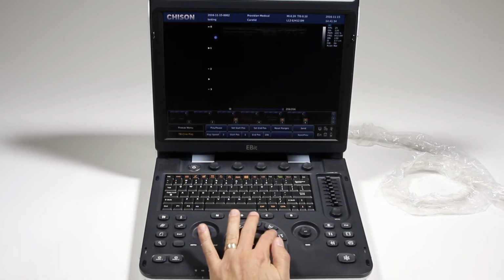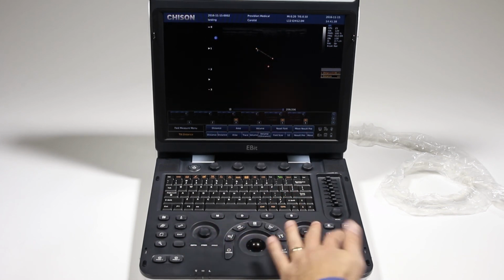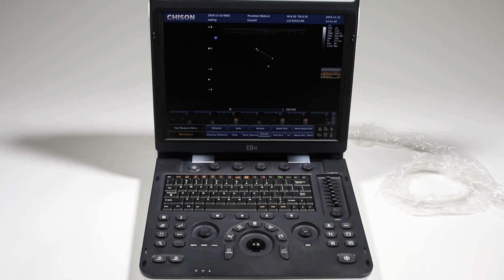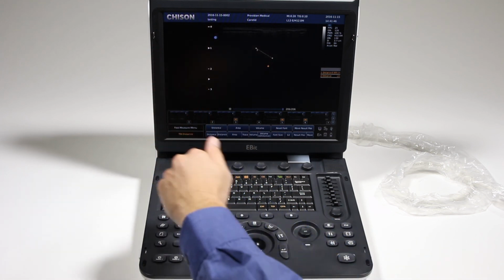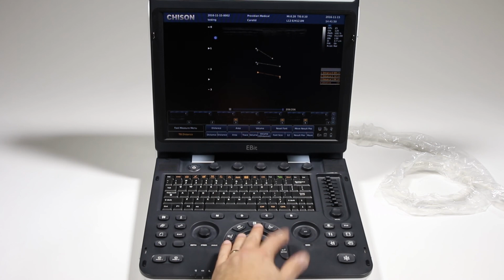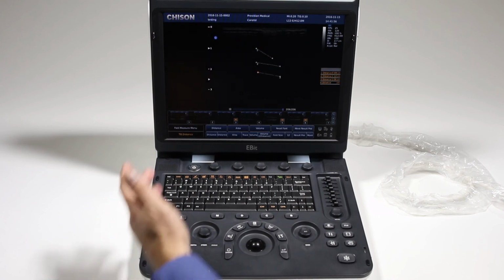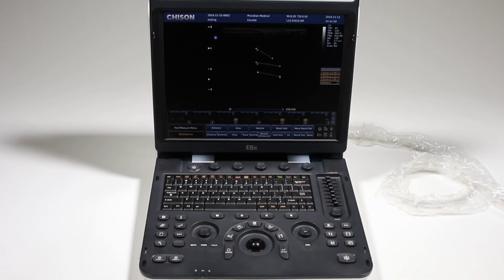These work the same, the distance and trace. If I just want to take a quick distance measurement, I can go ahead and do that and save the image. Note that any measurements here will not go onto report because they're not assigned to any report or calculation package. This is just for a simple measurement. If you take all of these, they will not show up in the report because it doesn't have anything to assign it to in the report. It really doesn't know what you're looking at. The report specifically will say what calculation it used. Next, we'll get into reviewing images and exporting.